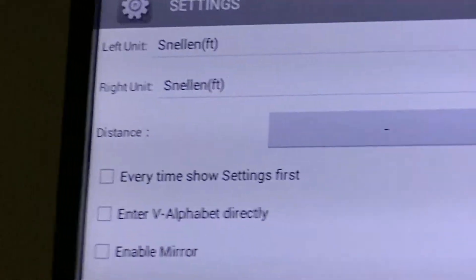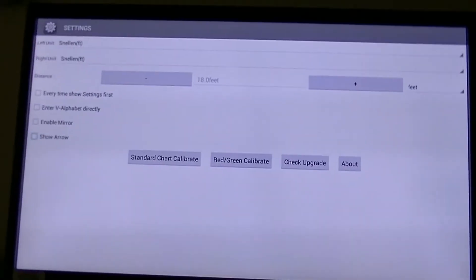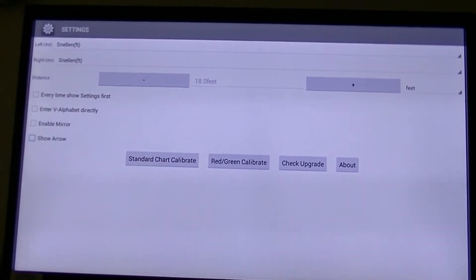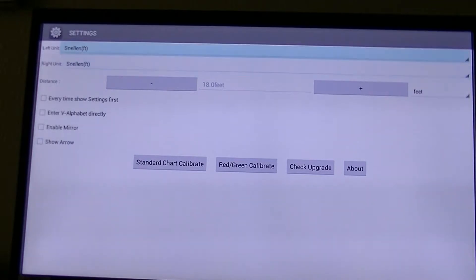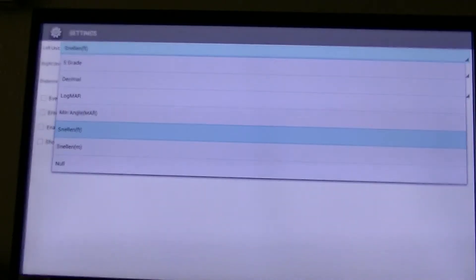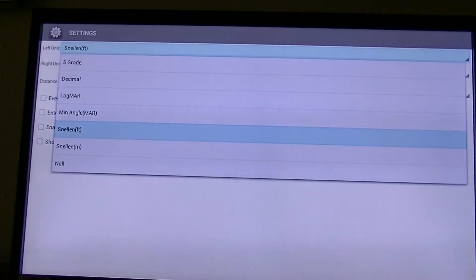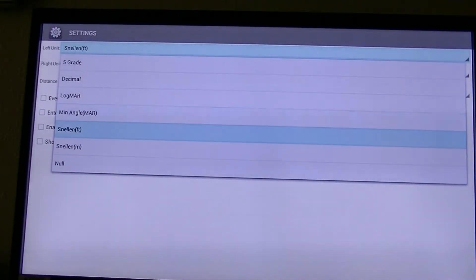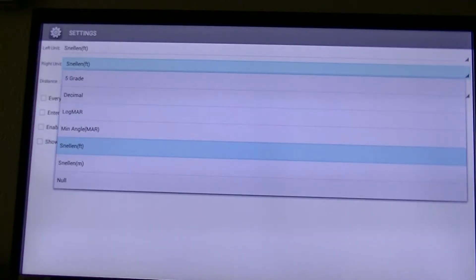So now we have to go back up and set the distance — that's what this tutorial is mainly about. When you get the unit, you're going to go into the very first one that says Snellen Feet and click by hitting the center button. You see you have all these different things: five grade, decimal, log mark, minimum angle, Snellen Feet, Snellen metric, and all. So you're going to go into Snellen Feet, highlight that, hit the center button, and now it will be locked in. You're going to do the same thing for the right unit and select Snellen Feet.